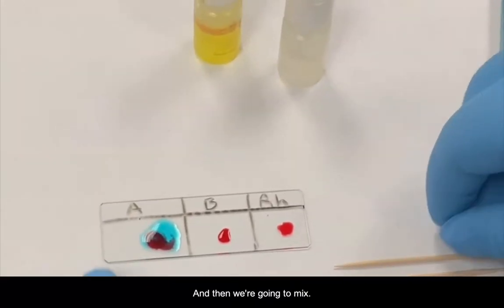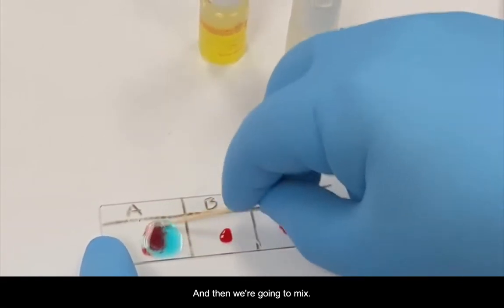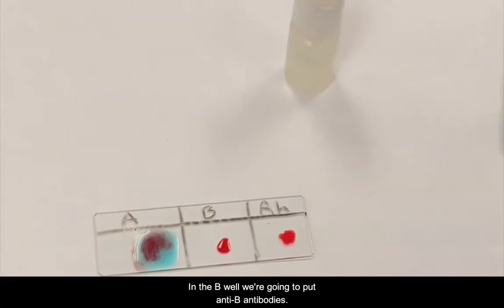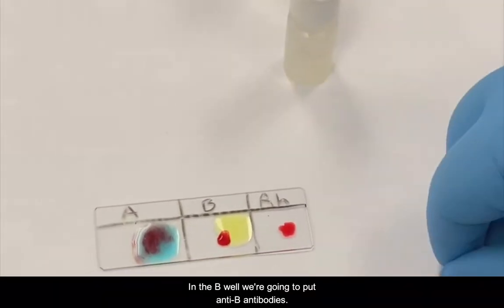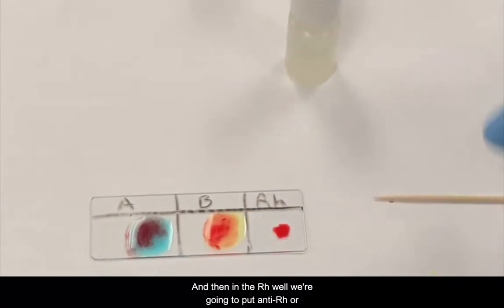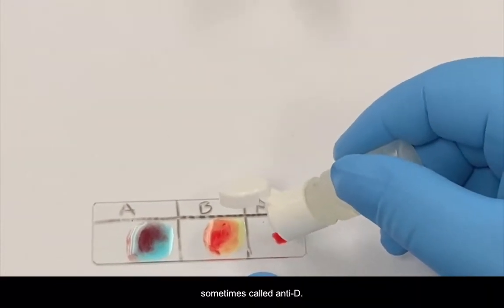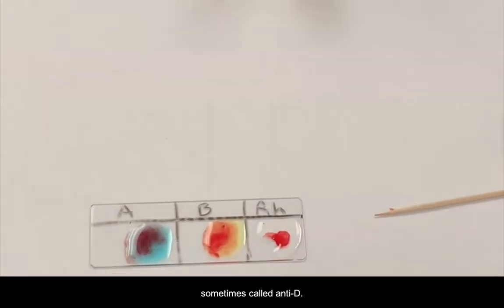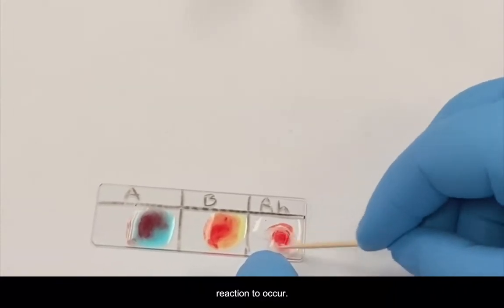And then we're going to mix. In the B well, we're going to put anti-B antibodies. And then in the RH well, we're going to put the anti-RH, or sometimes called the anti-D. And then we're going to mix and wait for the reaction to occur.